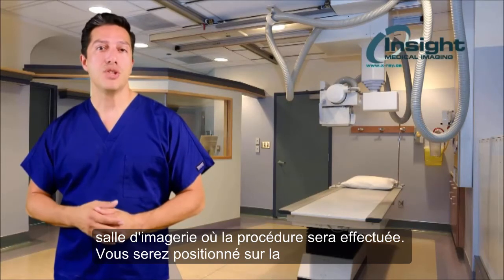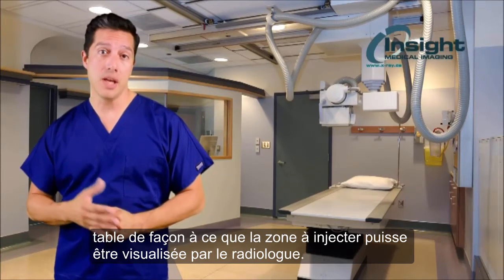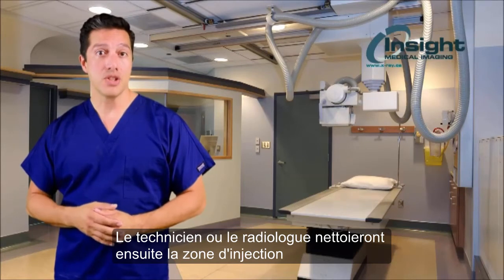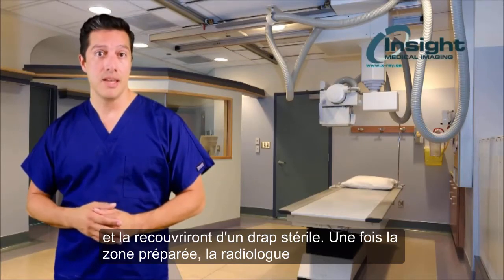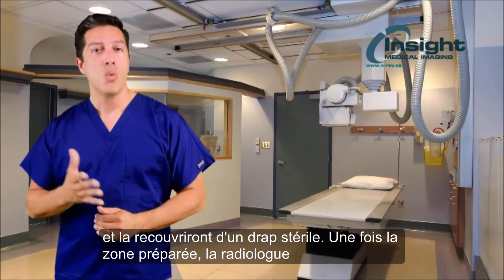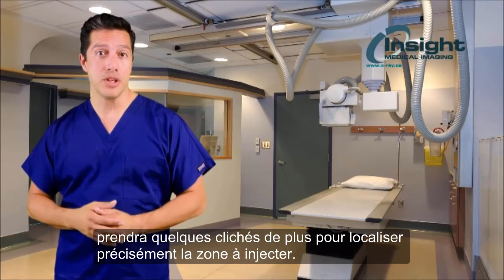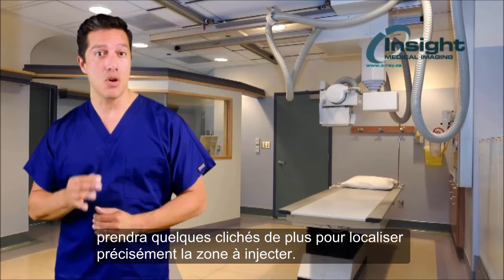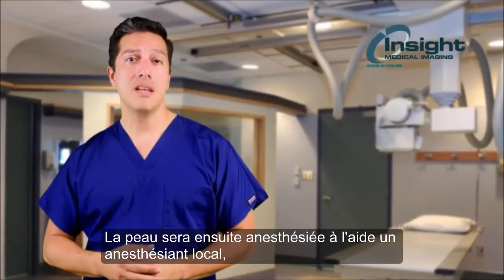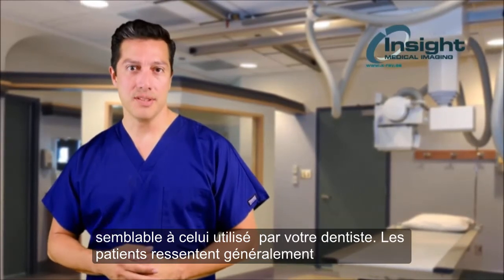You will be positioned on the imaging table so the area to be injected can be visualized by the radiologist. The technologist or the radiologist will then cleanse the injection site and cover it with a sterile drape. Once the area is prepped, the radiologist will perform some further imaging to precisely localize the target area for the injection. The skin is then anesthetized with a local anesthetic agent similar to what your dentist uses.